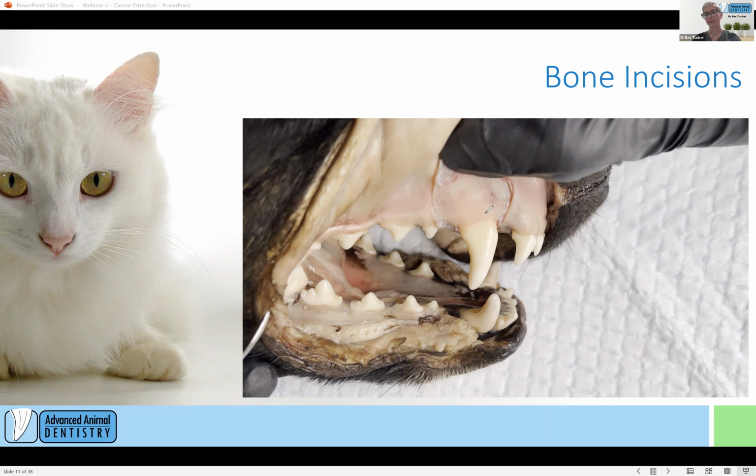And the other thing that we're going to do as well, so that will be a 3-sided cut. There's going to be a mesial cut, and then there's going to be a distal cut, and we will join those two as well. Now, it's not that much of a tip, it's actually a warning. When you do that third cut to join the two, don't cut too deep, or else you'll cut a big trench in the tooth that makes it weak and it may snap at that point.